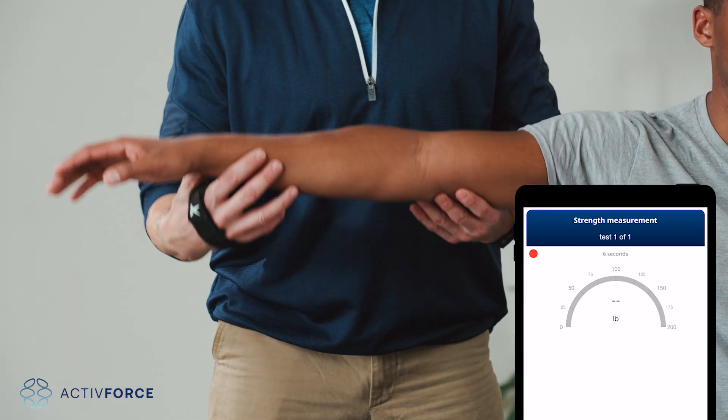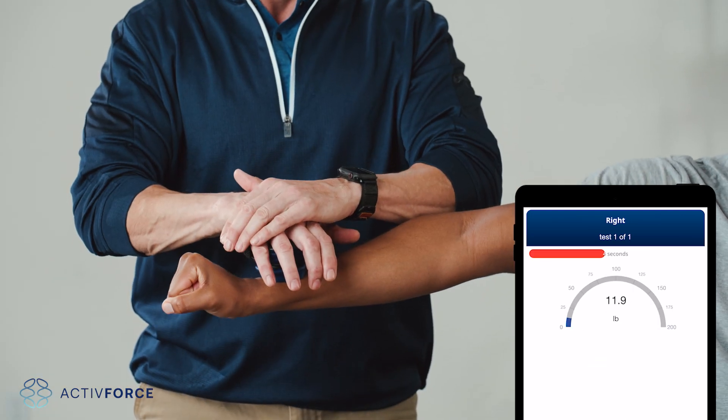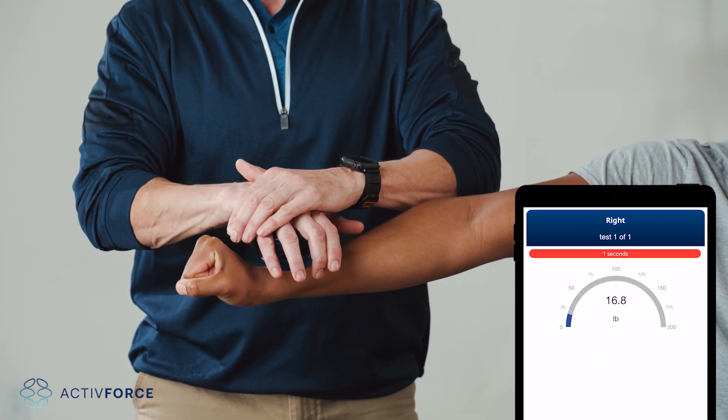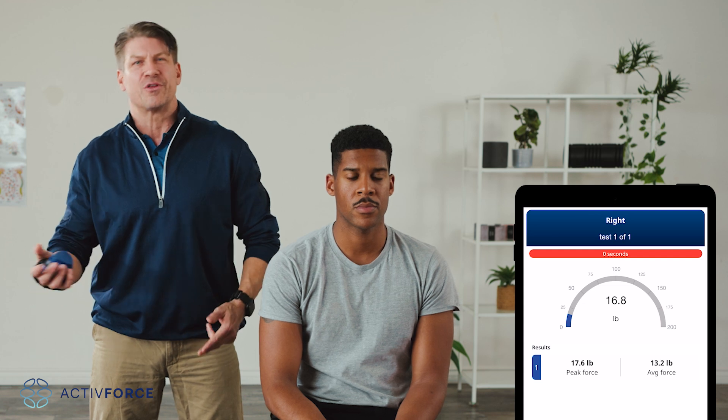Next, the test screen. Once you're on the test screen, put your patient in position and press Start. Then let the device calibrate in the test position. Now tell your patient to push as hard as they can against the device and record a strength measurement. You'll then have the option to move to the next side or redo the test. If you're happy with the test, you can read the results on the ActiveForce dashboard or go for another round.